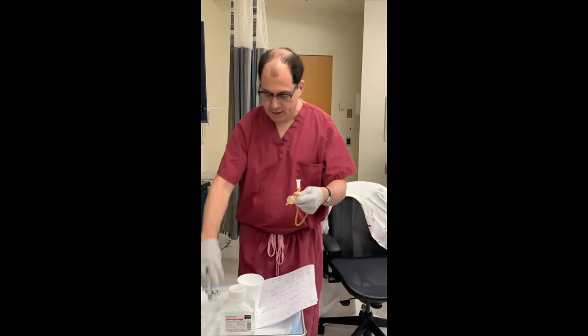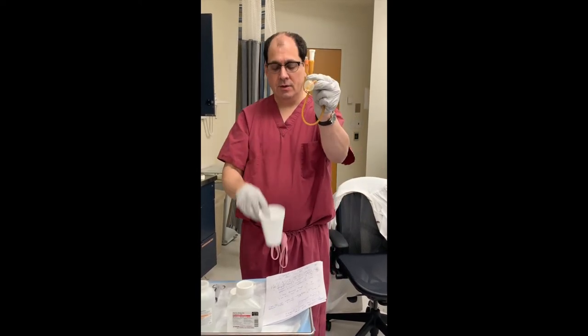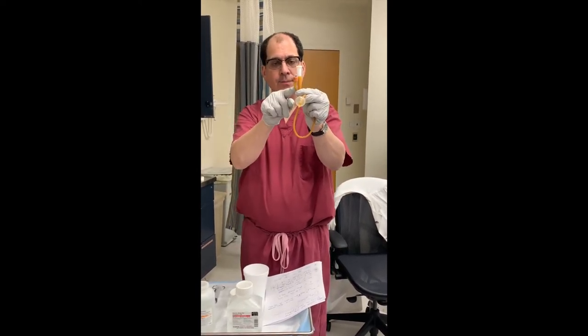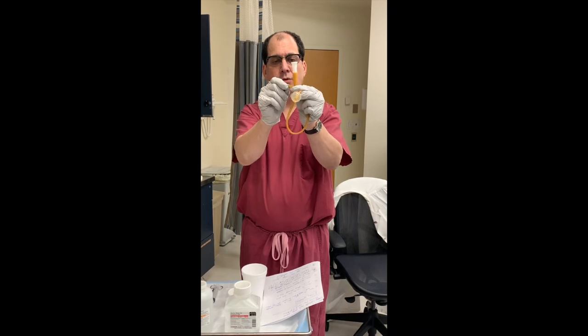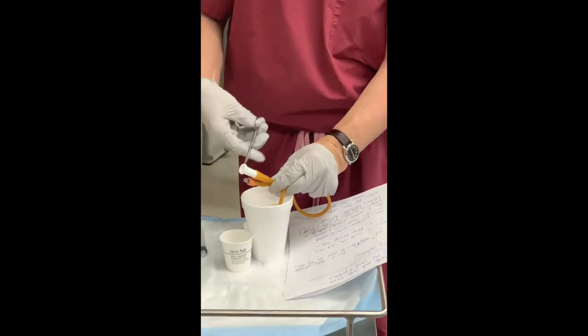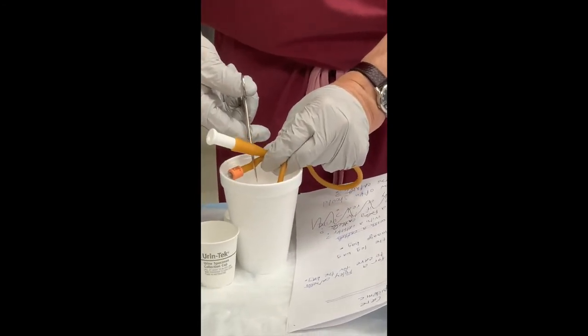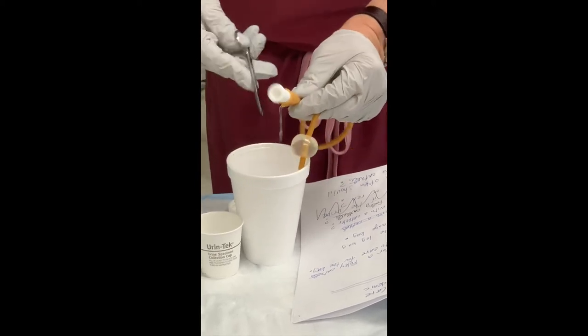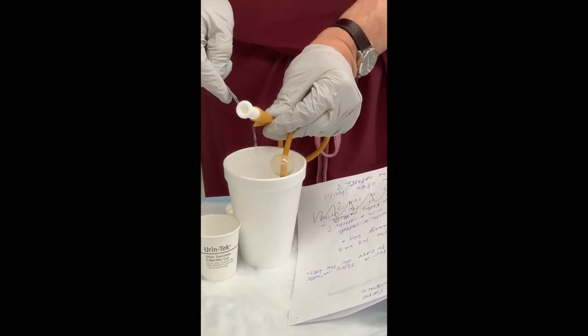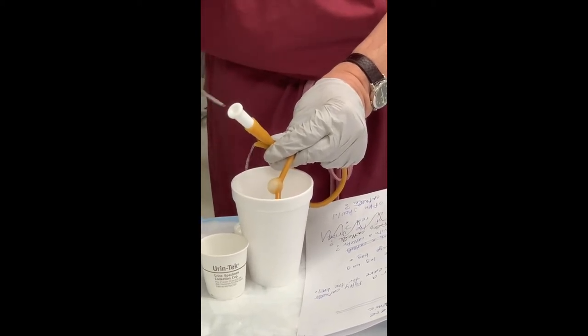What can you do? Get yourself a cup. Here is the balloon port — if you cut this balloon port off, this will deflate the balloon. Take the scissors and cut completely off right here. You can see there's fluid coming out of the balloon port, and at the same time the balloon is getting smaller.